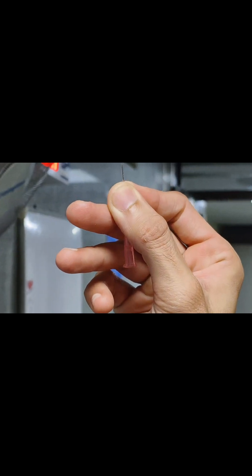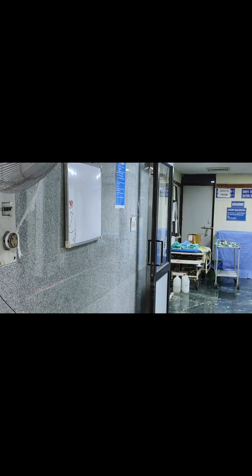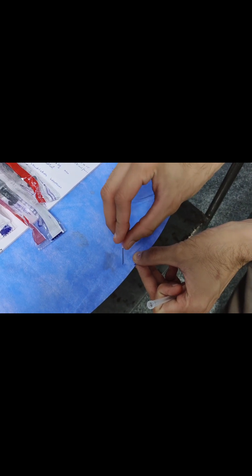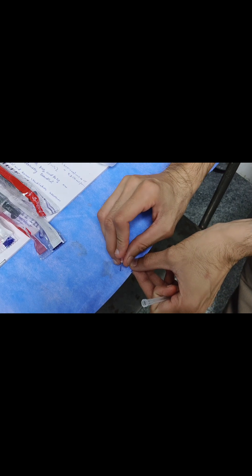With this parrot beak tip, when you try to pierce a fascia — for example, if I pierce this sheet — you can see it is not getting pierced easily. I have to put a significant force, then only it will pop like this.